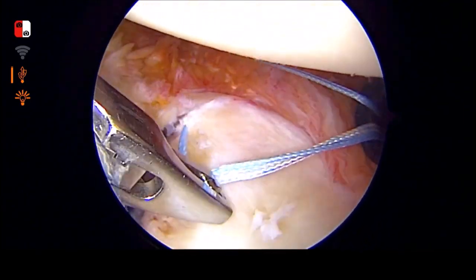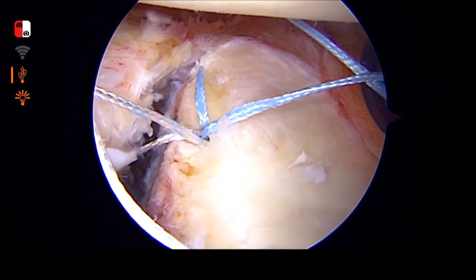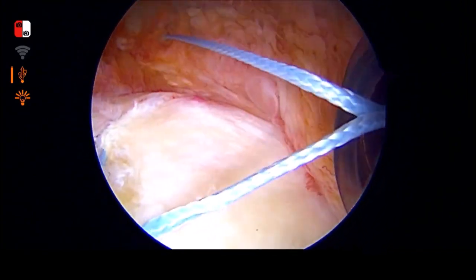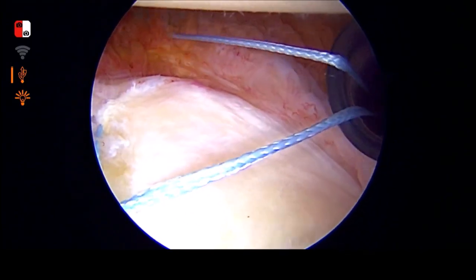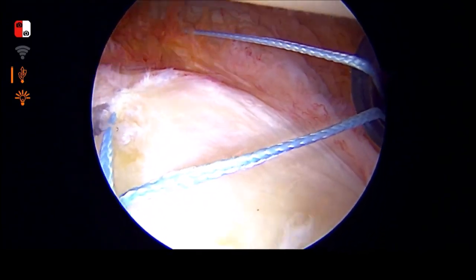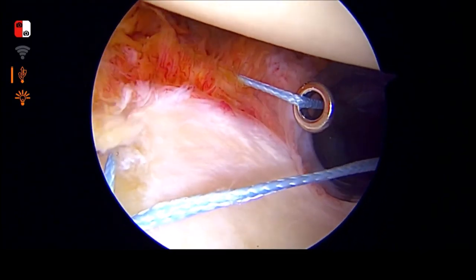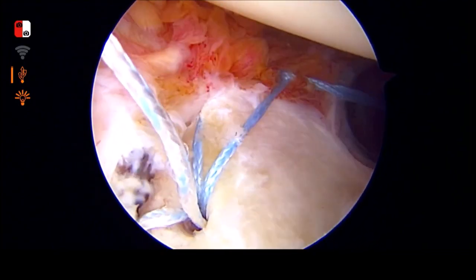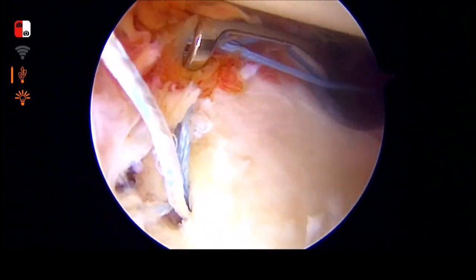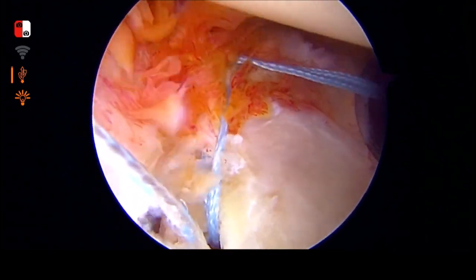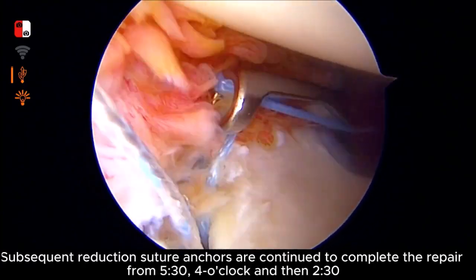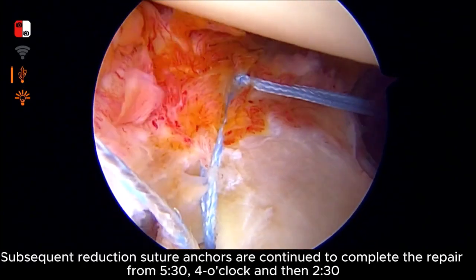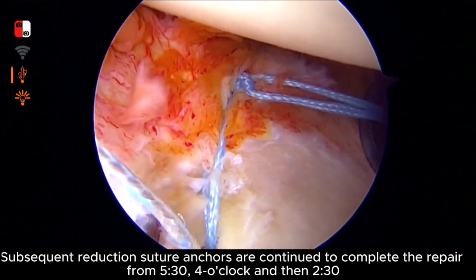Once all anchors have been placed, we proceed to tying down the Bony Bankart. Subsequent reduction suture anchors are continued to complete the repair from 5:30, 4 o'clock, and then 2:30.